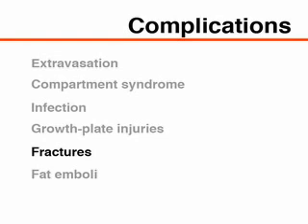Substantial force may be required to penetrate the bony cortex, particularly when using manual placement technique. Fractures can occur, especially in young infants or patients with osteopenia. Microscopic fat emboli have been detected in animal studies. However, pediatric case series have not reported adverse outcomes related to embolic events.